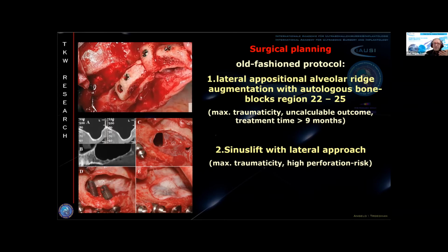And we know from experience, and we proved this also, as I will show you a little bit later on in a comparative randomized clinical trial, that of course you have procedural resorptions. And if you listen carefully to lecturers at some congresses, you will always see that they transplant an autologous bone block, they screw it, and then they place some synthetic or artificial bone graft around. Why do they do this? Because they perfectly know the autologous bone block is resorbed sometimes by 50%.